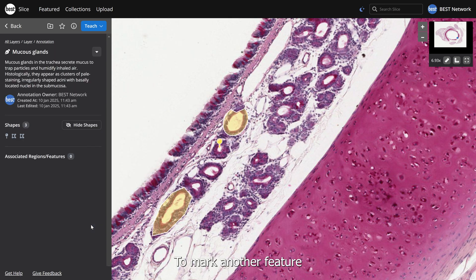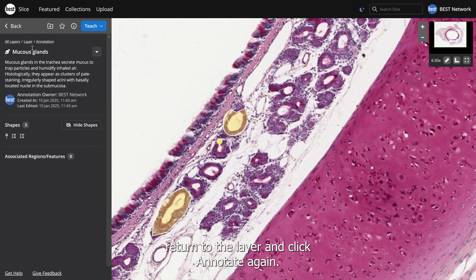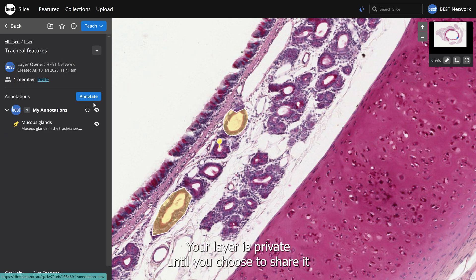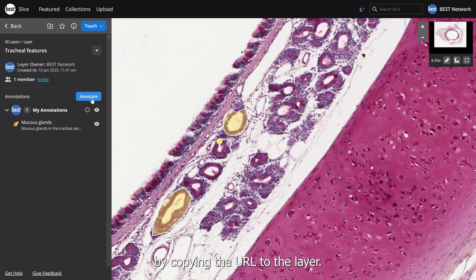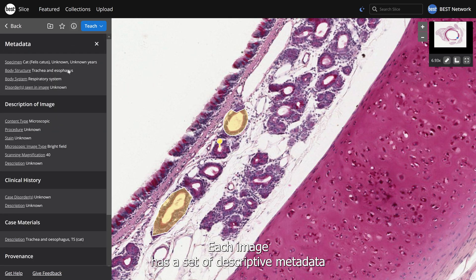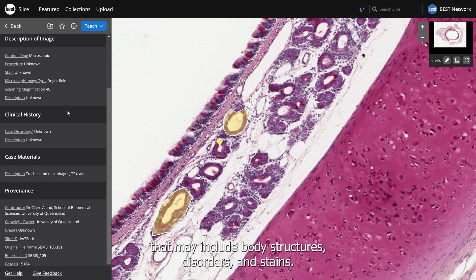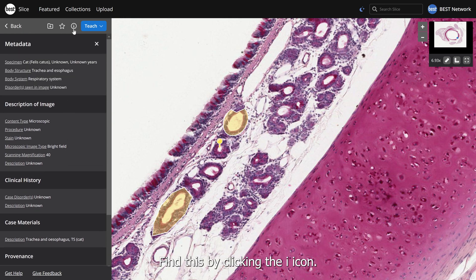To mark another feature, return to the layer and click Annotate again. Your layer is private until you choose to share it by copying the URL to the layer. Each image has a set of descriptive metadata that may include body structures, disorders, and stains — find this by clicking the eye icon.